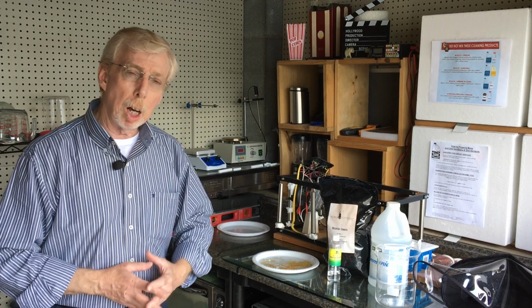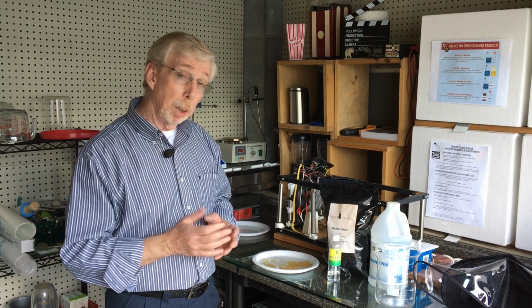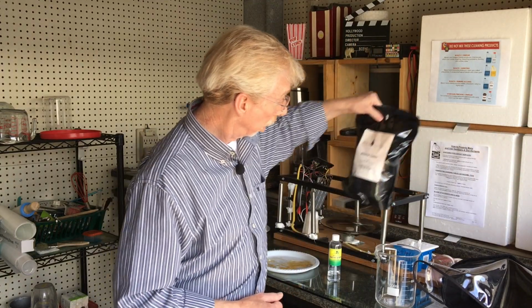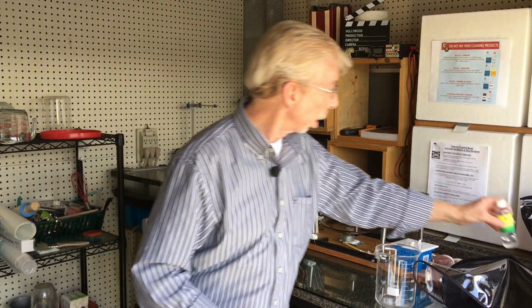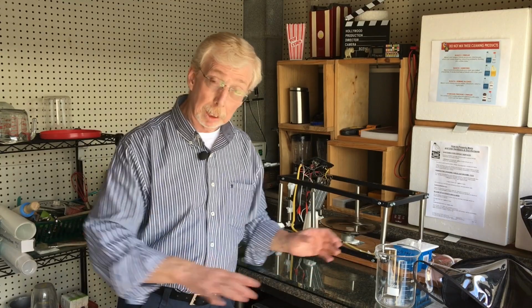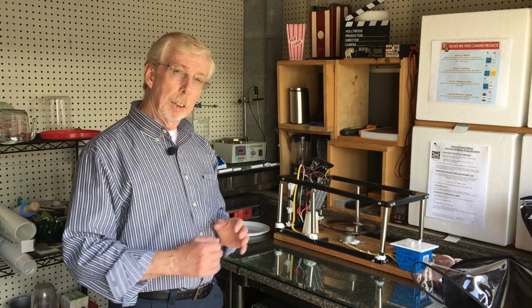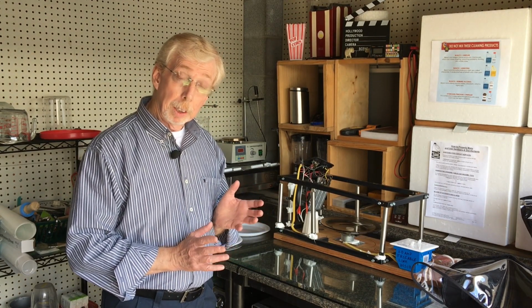So I'm going to introduce something that I use to eliminate that problem, and it may also help you as well. If you want to do this on a small scale, I'm going to show you how I did it. So let's examine this little construct that I have in the back here. And I test a lot of things with this. It actually sits on the other side of the lab usually. And it's a very simple thing to build when you dig down just a little bit. If you're handy with electrical things, then you'll be just fine.